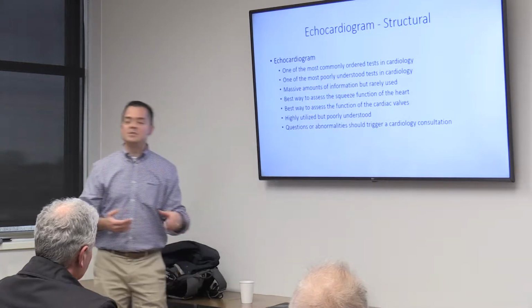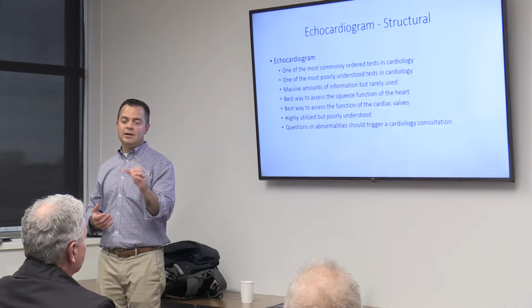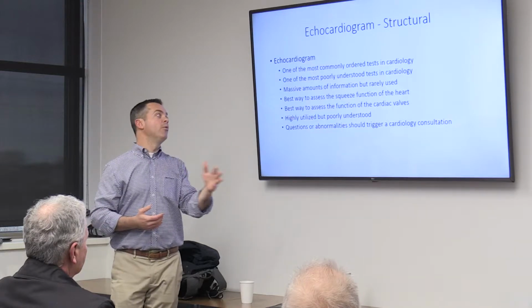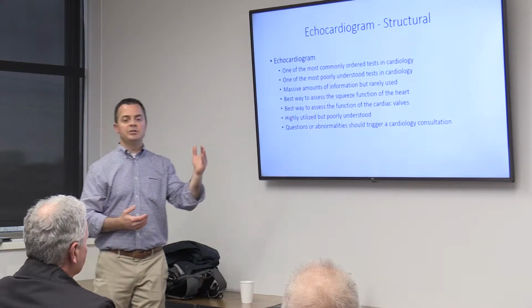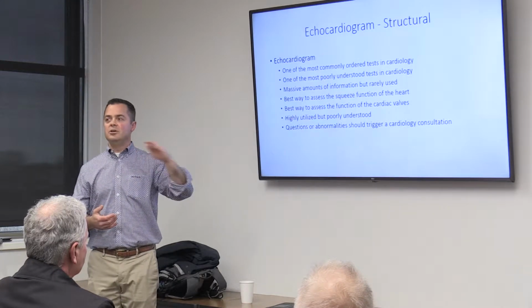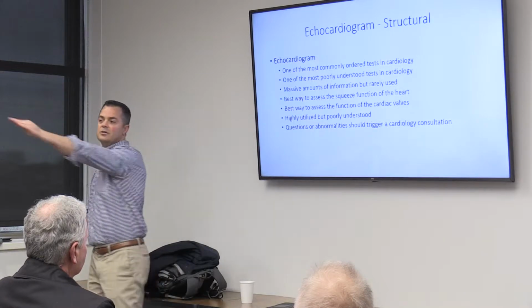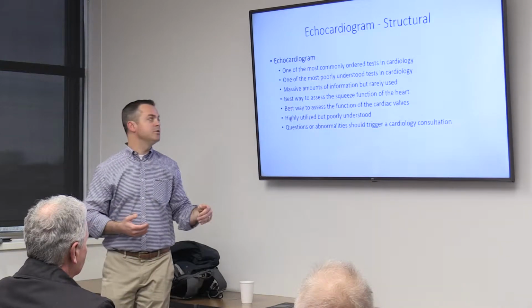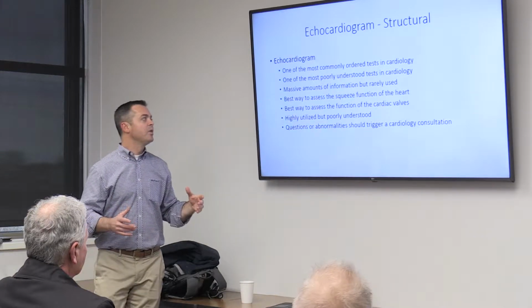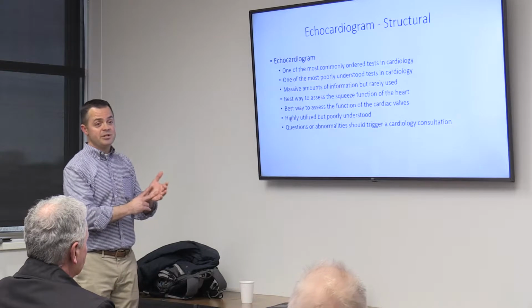Okay, this is the other big money test in cardiology that happens a lot. And these are ultrasounds or echocardiograms. Okay? By far one of the most commonly ordered tests in cardiology in the 10 years here and 2 years in Madison. You know, I mean, the volume of tests with echoes is going just like this. It just keeps going. And some of that is appropriate, and some of it gets a little crazy. It's one of the most commonly ordered tests in cardiology. It's one of the most poorly understood tests in cardiology.